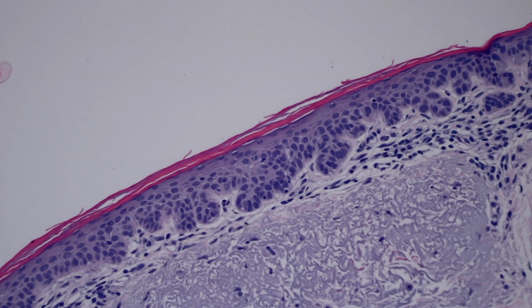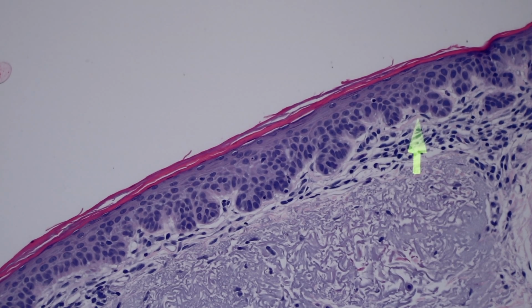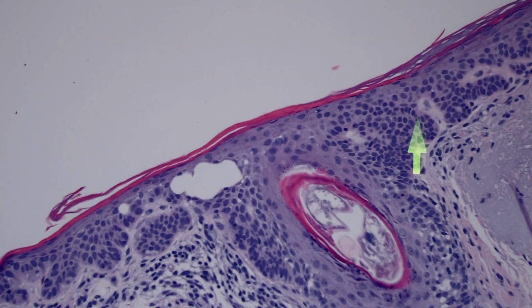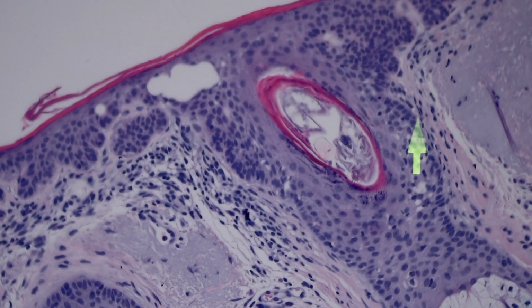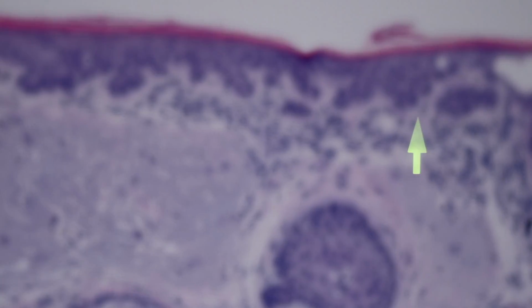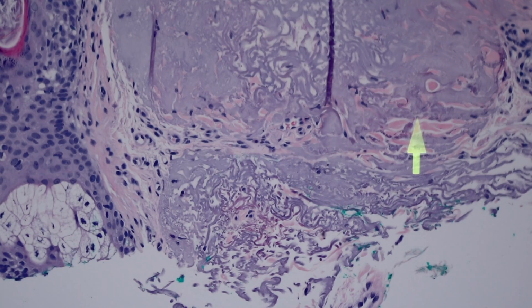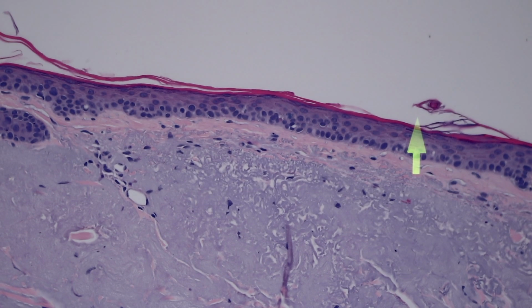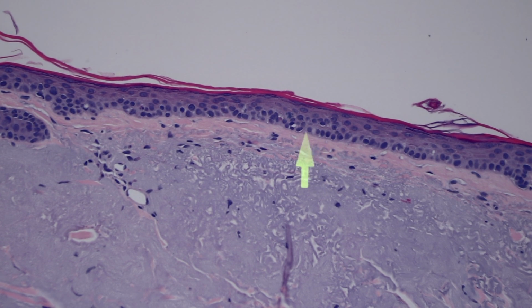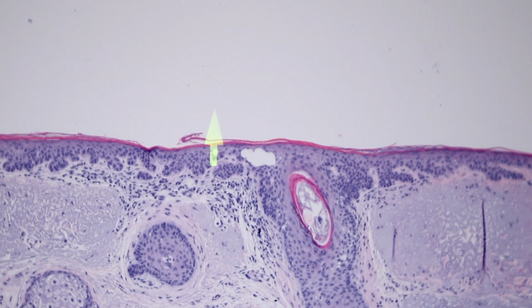another good example of the atypical kind of jumbled, slightly busy look that the basal layer has. The basal layer looks like there's too many cells in here, and so it looks kind of jumbled, disorganized, busy, whatever name visually works for you, use that. Just find the name that works for your mind, and then that can be your visual clue. So that's actinic keratosis there, and over here you can see more of the basically normal, or normal for this sun damaged person, but this is their non-actinic keratosis portion of the epidermis, and there's the actinic keratosis.